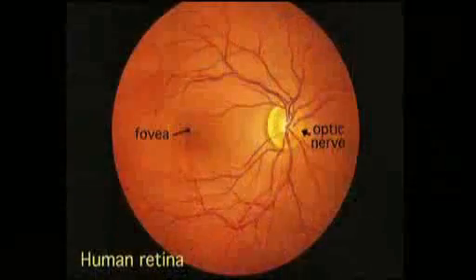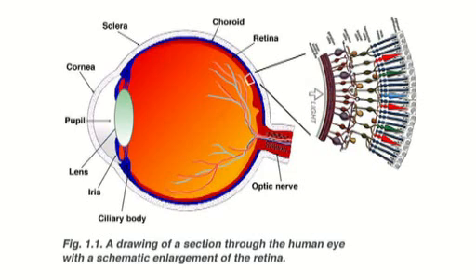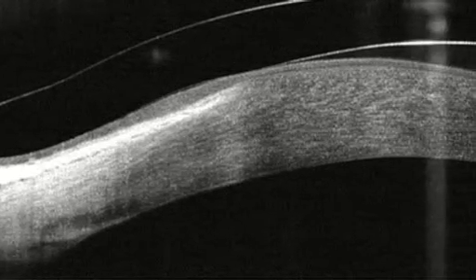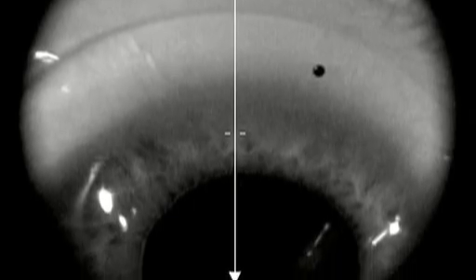I'd like to introduce you to the OCT, or the Optical Coherence Tomographer. This instrument is a fantastic tool we use to evaluate the front, the middle, and the back of the eye. It was originally created for evaluating the retina and the optic nerve, so the retinologist and the glaucoma specialist embraced this tool, and the newer generations allow us to see the front of the eye. I like to use this not only for those purposes, but also to even evaluate the fit of contact lenses on the eye, and I'll talk more about that under the heading of scleral lenses and corneoscleral lenses.